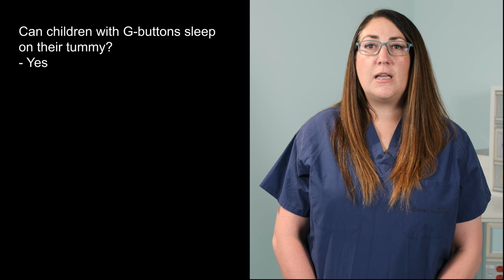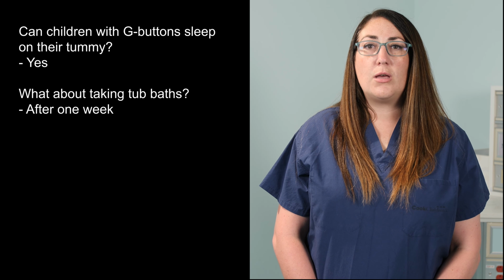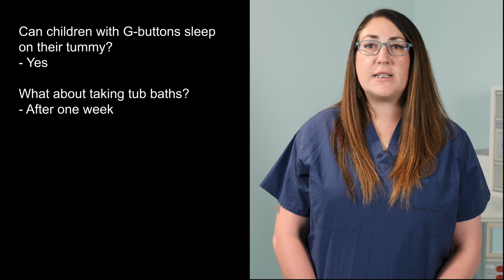Here are some questions parents and caregivers often ask. Can children with G buttons sleep on their tummy? Yes, children with G buttons can sleep in any position that is comfortable. What about taking tub baths? It is okay to take tub baths after 1 week.